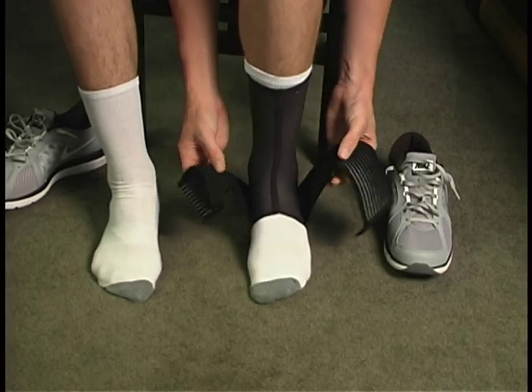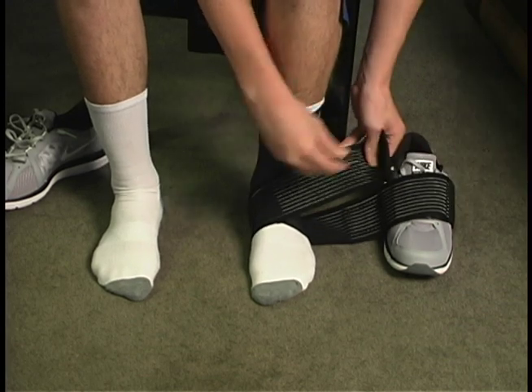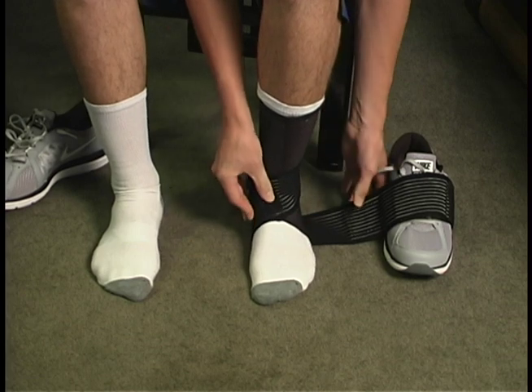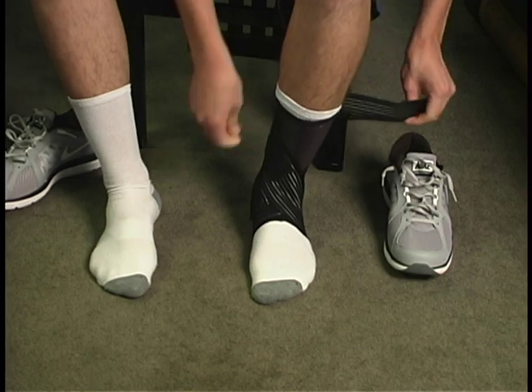Always start with the short strap. Wrap the short strap low around the ankle. Wrap the long strap high around the ankle, overlapping the short strap.